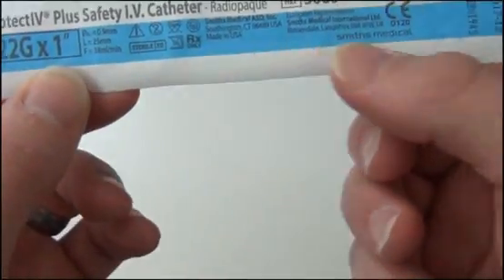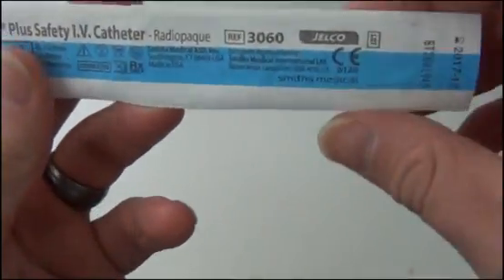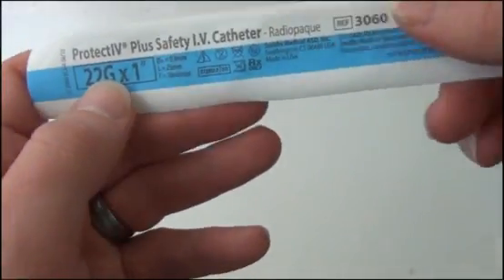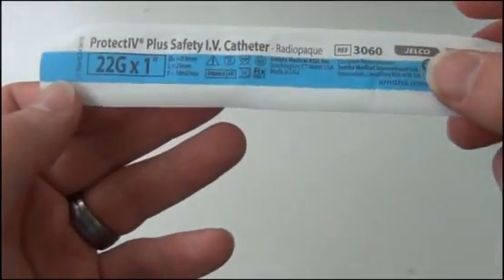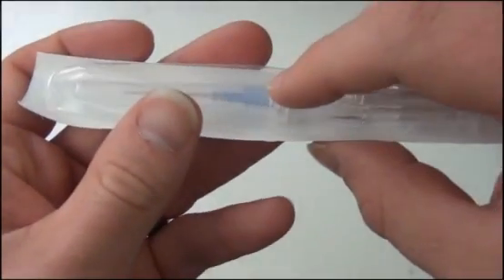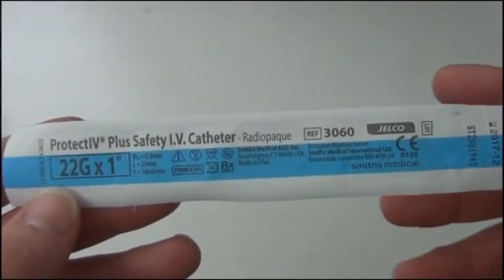And with the Gelco, they're all color-coded. On the packaging here, you see this blue color, that's also the color on the hub. So this is a 22-gauge, and then we have the 20-gauge, which is pink, pink here and pink here. And then we also have an 18-gauge, 18 is green and green here. There's multiple other sizes that will just depend on what your hospital orders and what they use most often.